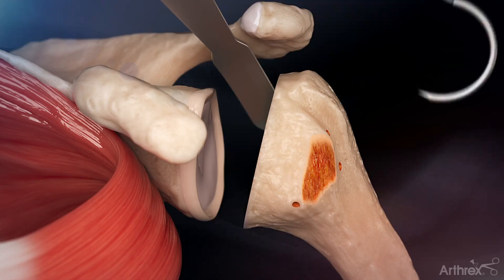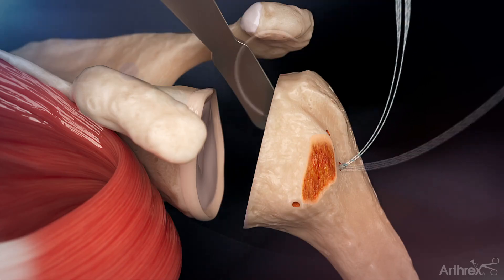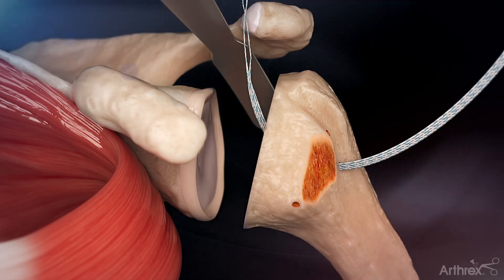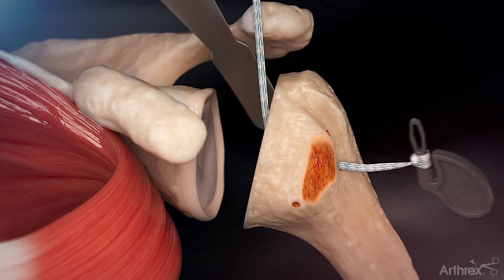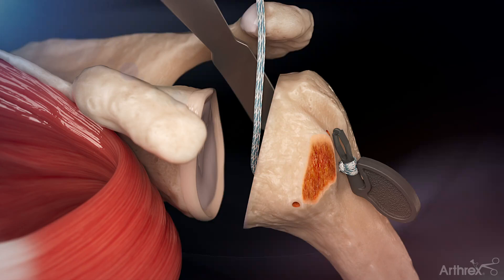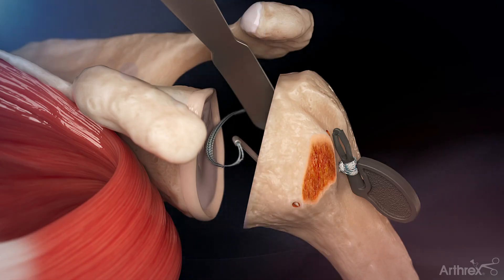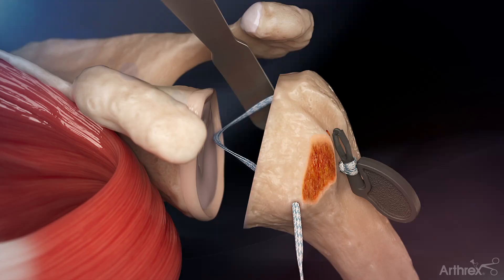The fiber tape loop is removed from the card and its needle is passed through the inferolateral humeral bone tunnel. Configure the suture loader so that suture limbs enter the bone tunnel directly from the suture loader. Care should be taken to ensure the nut does not migrate off of the suture loader as the suture strands are being pulled proximally through the bone tunnel. The needle is then passed from the interior of the humeral canal through the medial bone tunnel, and the suture is pulled through while ensuring that a loop of suture is maintained external to the humerus.